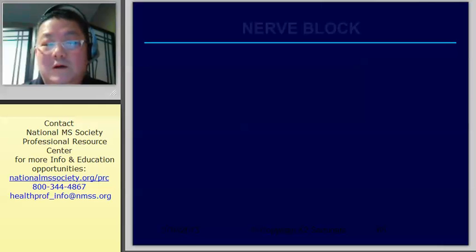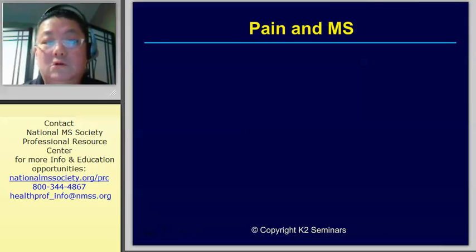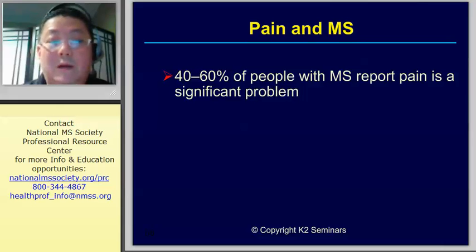Alright, so above and below the area you want to cause nerve block. So if I was going to stretch out that tight patient that we saw, applying the electrodes in these positions will potentially determine whether or not it's high tone or a contracture. If it's high tone, by default this should open up and you should not have that tightness any longer. Once you have the tightness resolved, then you can weight bear, reduce some of the tone using some of the Bobath principles.